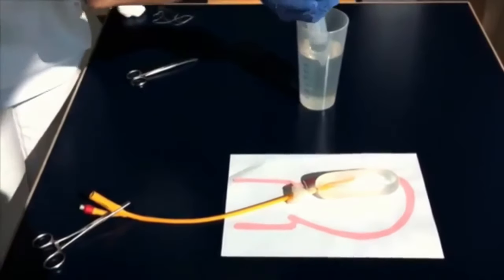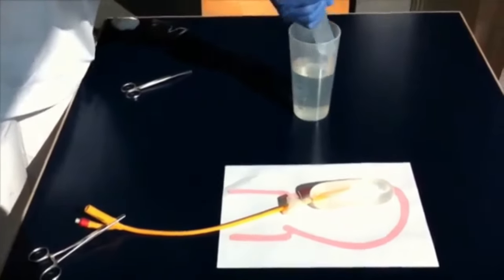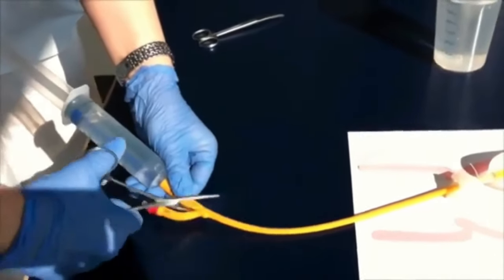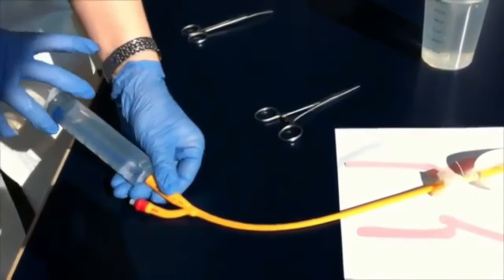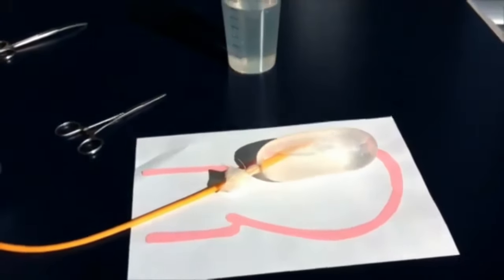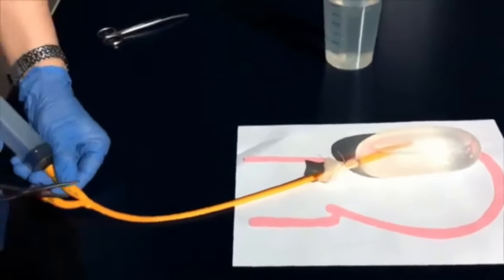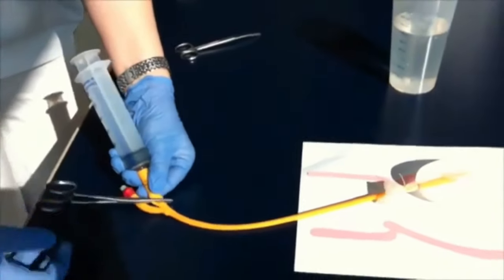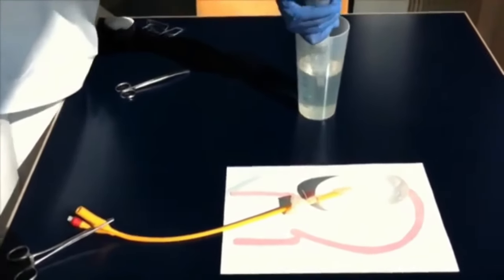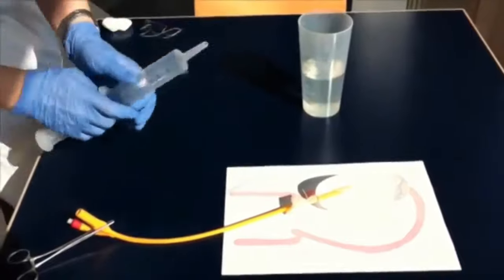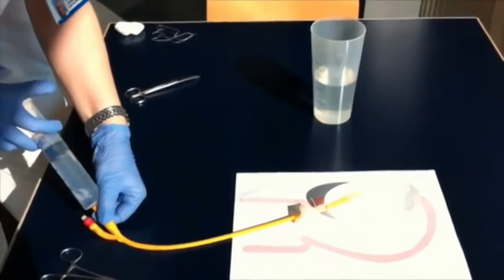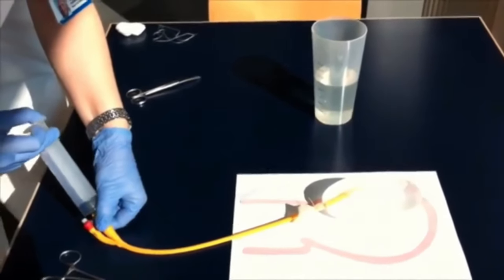One is from where we inflate the balloon when we use it for urine evacuation, but the other part is from where he is inflating the balloon for the uterine balloon tamponade. You can also take—I told you, you should have a second Foley's catheter. The first part, from where we inflate the balloon, you can use that end of the valve and put that part from the second balloon into this first Foley's catheter which you are using for making the UBT.